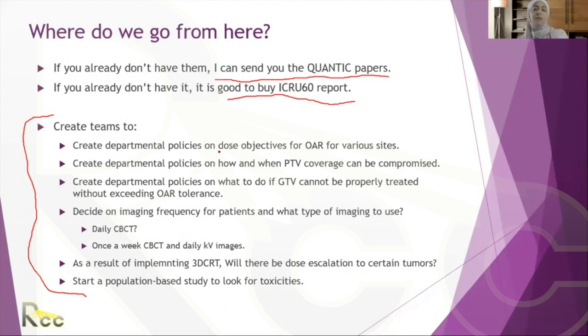And don't forget that treatment also has imaging modalities, as new linacs have imaging modalities. So does it make sense to be imaging with cone-beam CT for a breast patient on a daily basis? No, of course not. But maybe is it worth doing that for a head and neck patient? I would ask you, how good is your immobilization technique? So you do need to create teams and start working on it.